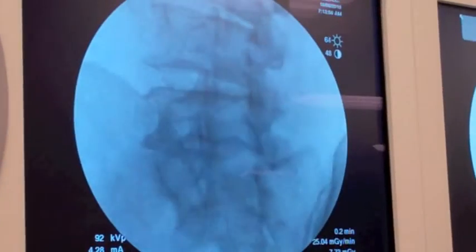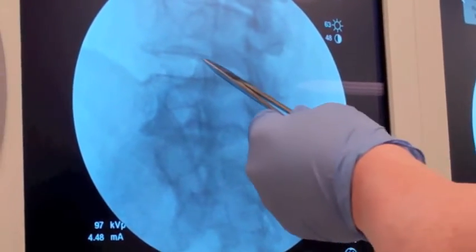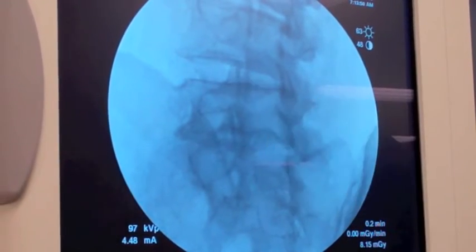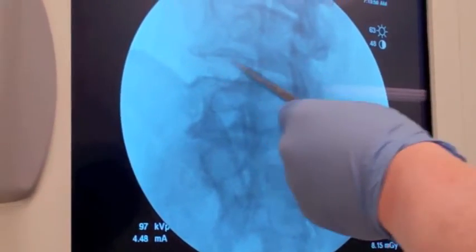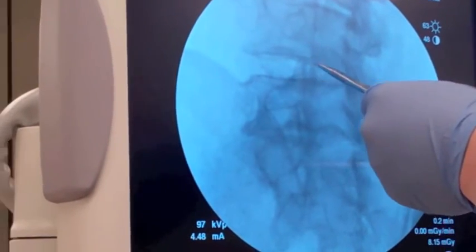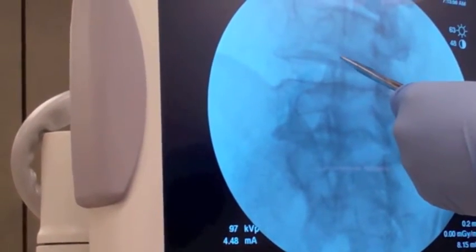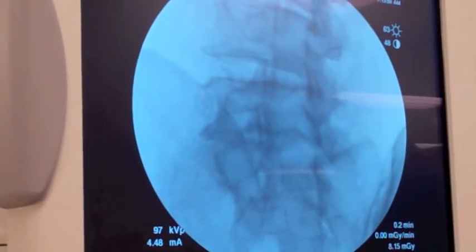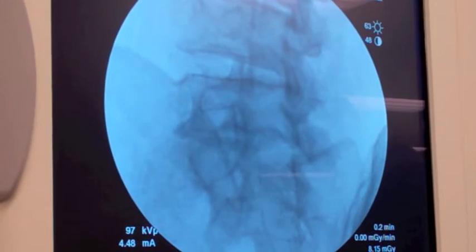We go a little bit more — this is the perfect angle. I'll place my needle just lateral to the superior articular process at the L4-5 disc. By obliqueing this far where the superior articular process bisects the vertebral body above, the nerve root is out of play, meaning there's less risk of injury to the nerve.